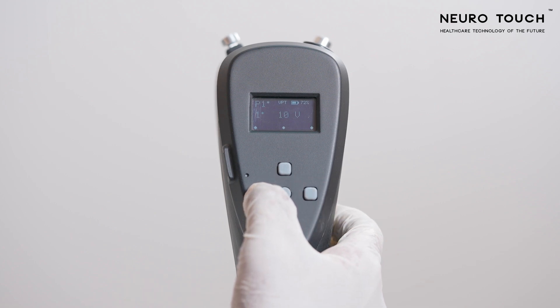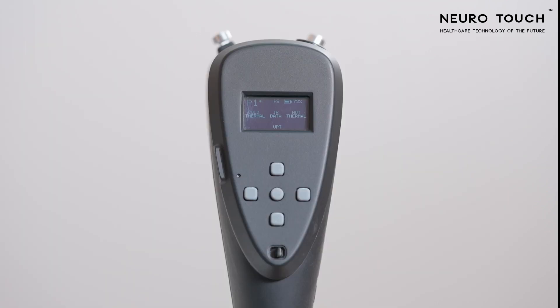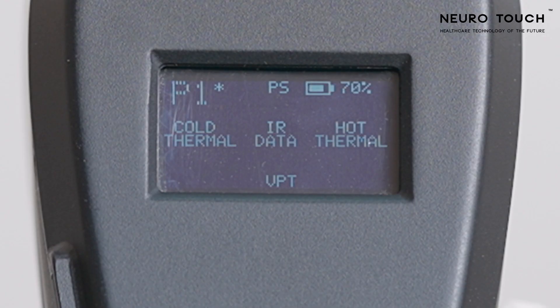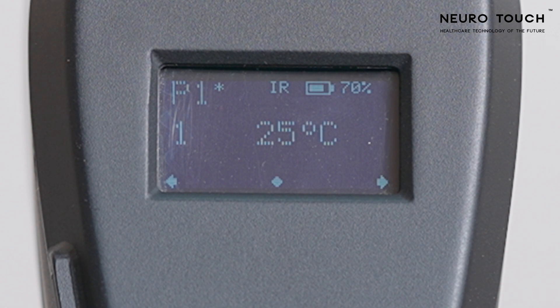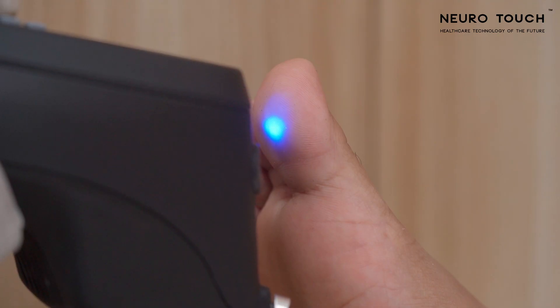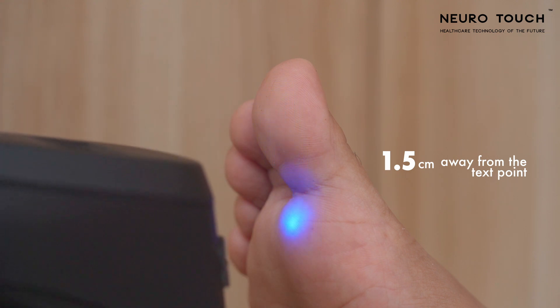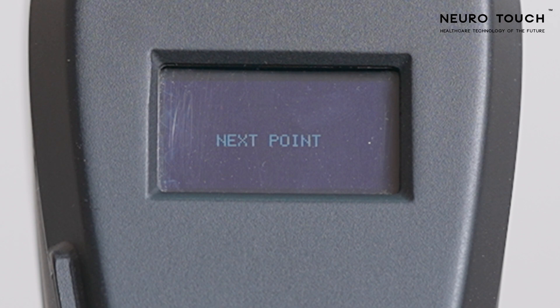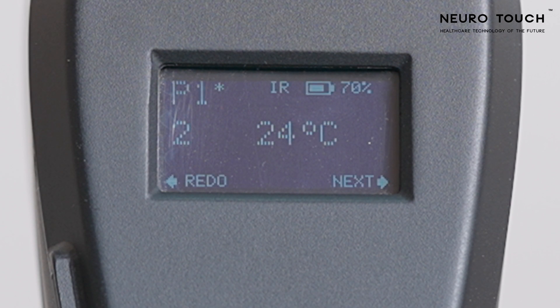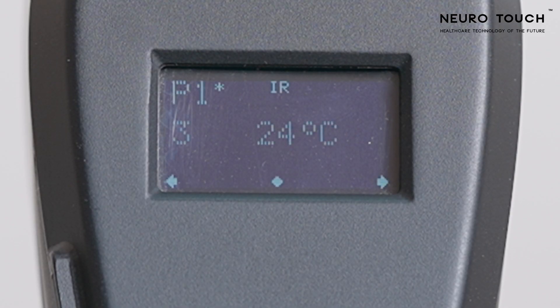IR Thermal Screening. To screen the foot temperature, start the IR thermometer test by clicking the center key. A blue LED light will glow at the front of the device next to the IR thermometer. Hold the device less than 1.5 centimeters away from the test point. Save the value by pressing the center key followed by the right key. The test automatically proceeds to the next test point.